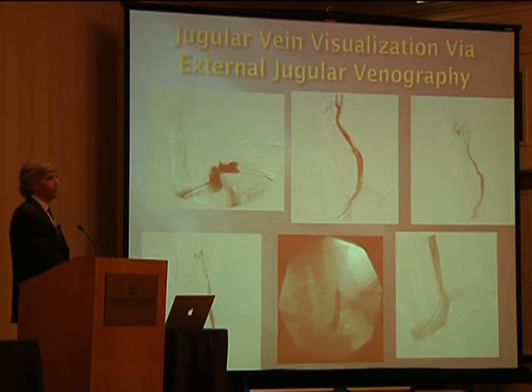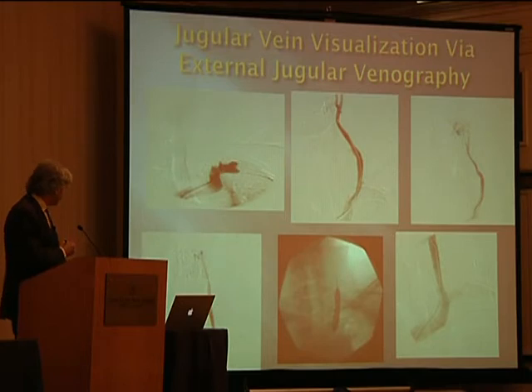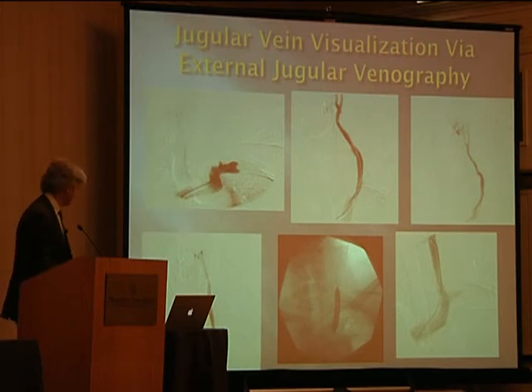The alternative to this would be, and this is a problem that we see not uncommonly, to directly stick the jugular vein with a needle, run a wire down the jugular vein, and snare it from below, and then come up and run a balloon up into the jugular vein, although that's a little bit more cumbersome, I think, than just coming from the arm or injecting the external.